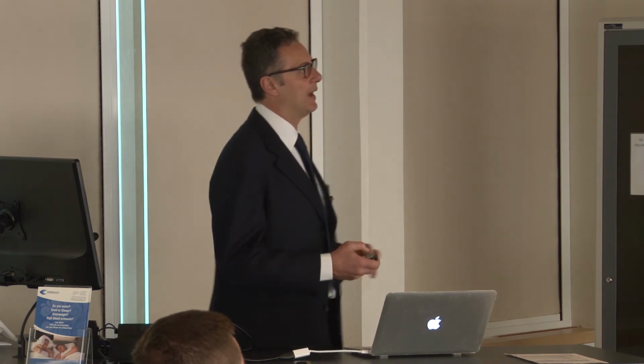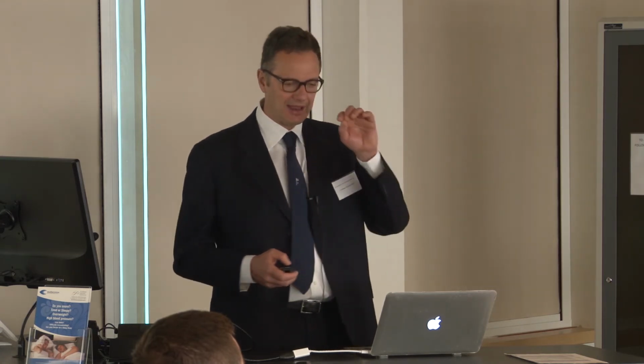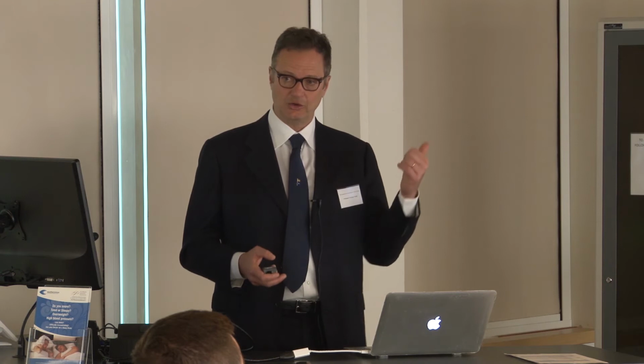By contrast, when we have some abnormal mucosal wave, no hydrodissection, and we can detect some atypical vascular pattern, we perform a subligamental chordectomy, as I showed you before.